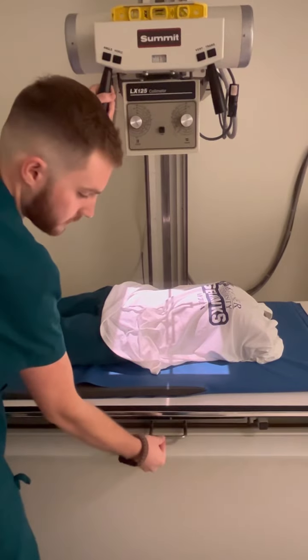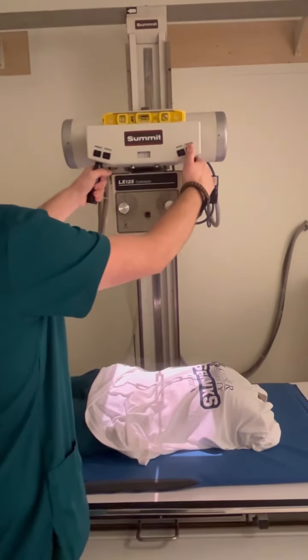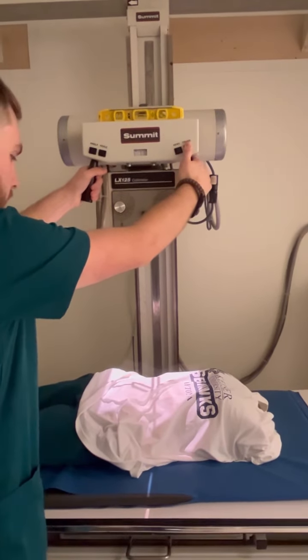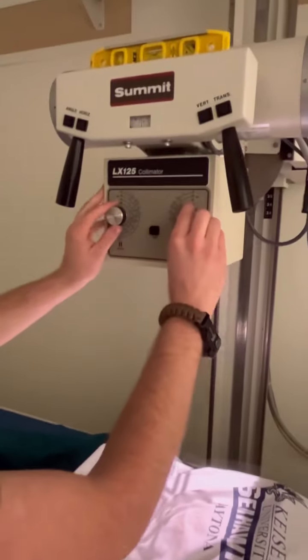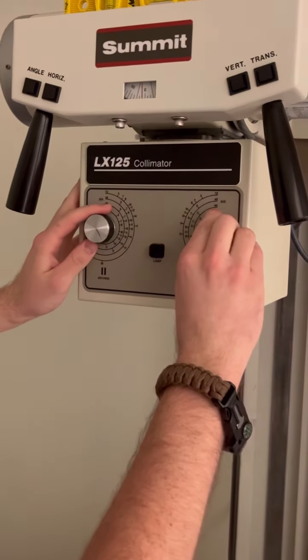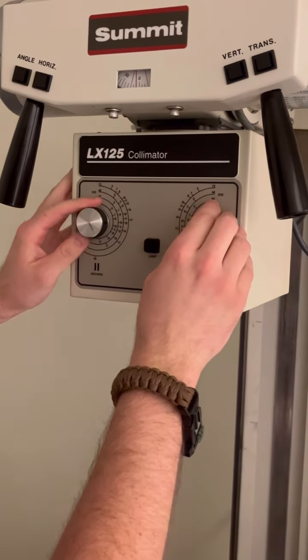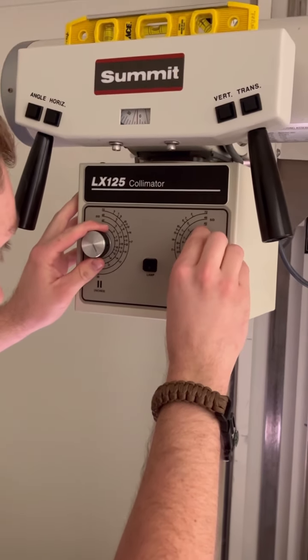Then we'll push our bucket back onto the table. Okay, and then we're going to go back into detent. Just right there. Okay, so these are all aligned now, so I'm not going to be moving those anymore. I'm just going to make sure my collimation's good. We're doing a 14 by 17 lengthwise. And then we're going to be doing a crosswise shot afterwards.